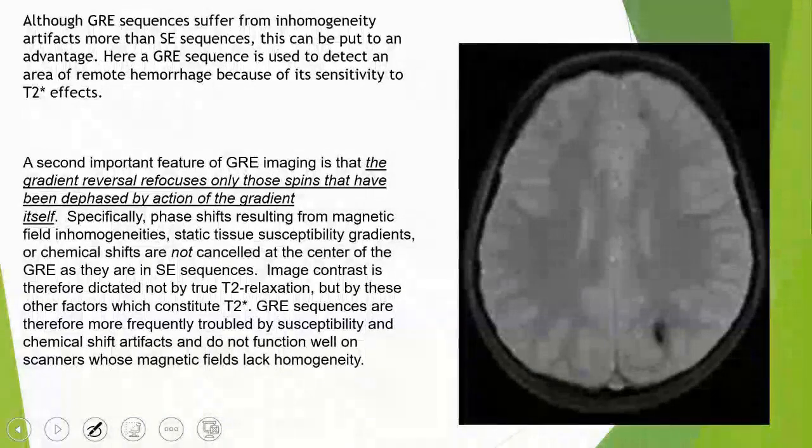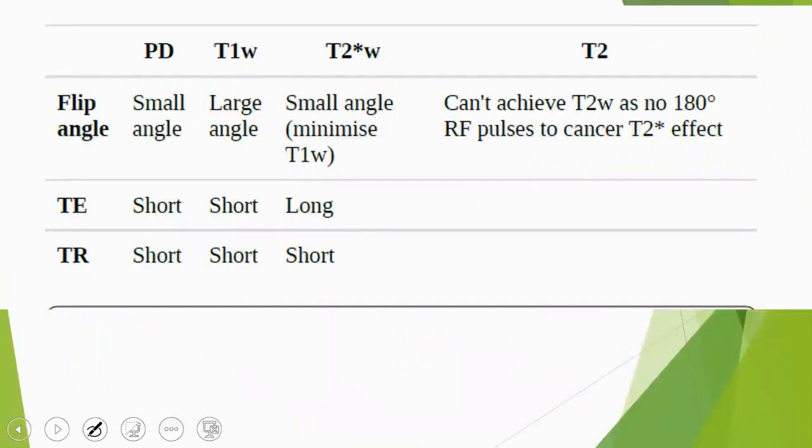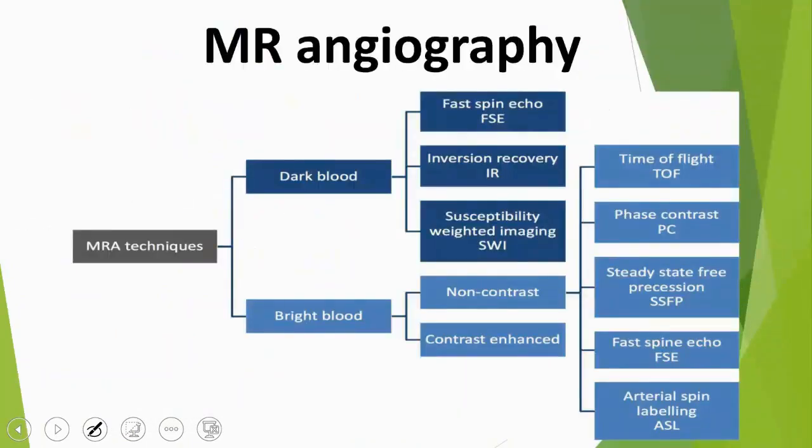Okay. There is an important point when we enter the topic of MR angiography. Did we understand that the gradient sequence is fast or slow? Fast.